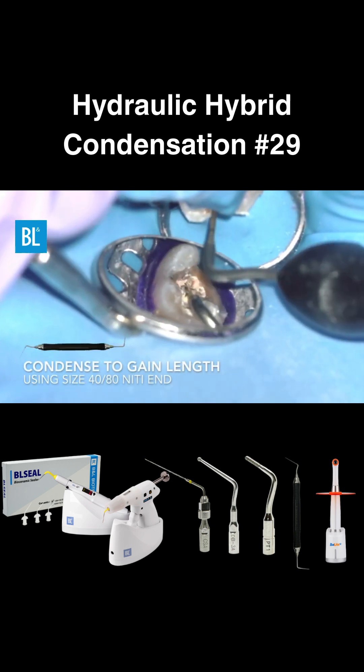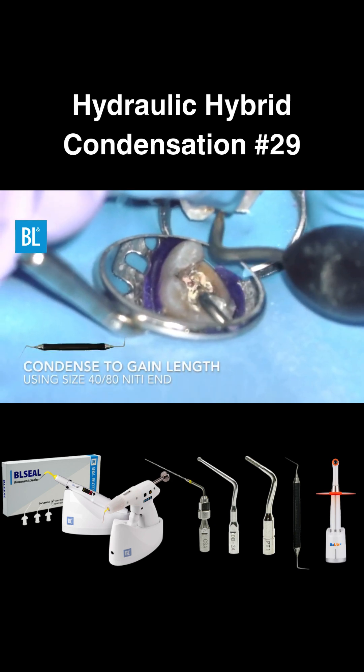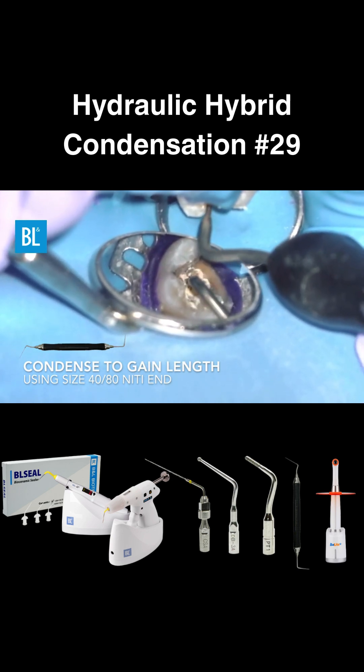Then switch to a size 40 nickel titanium condenser to compact the gutta percha for a denser apical fill.